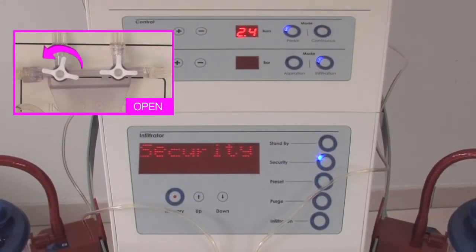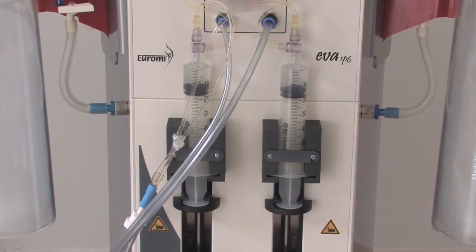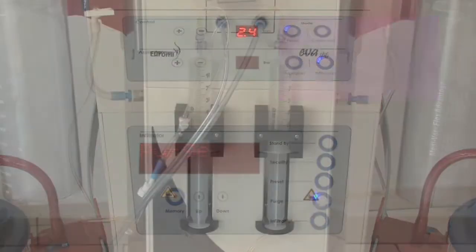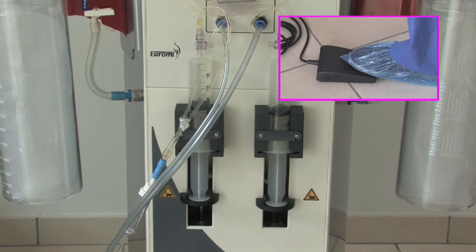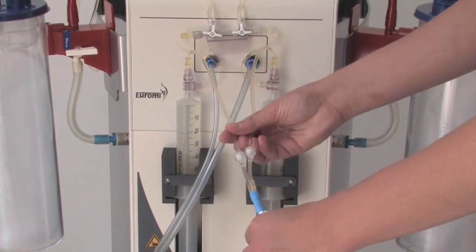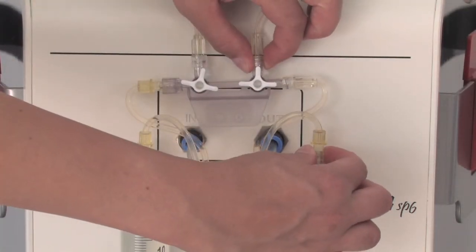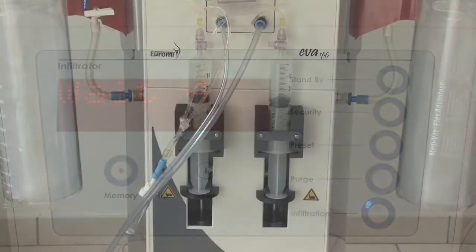Press security button. Flashing buttons are suggestions for the next step. Press preset button to fill the syringes. Lighted buttons show the active mode. Press purge button, then press on the pedal to start the purge. Check that there is no air in the tubing. If you notice air bubbles, check all the connections. Press on the infiltration button to start the operation.